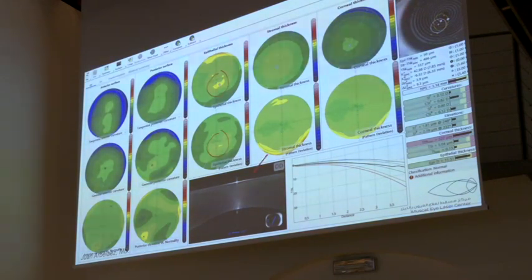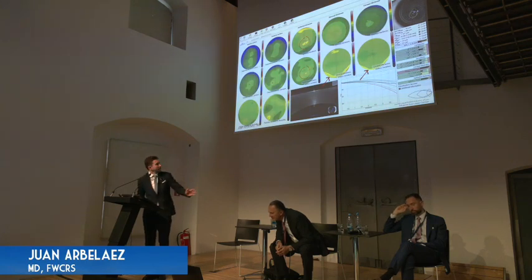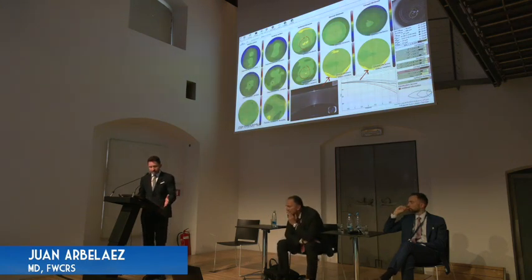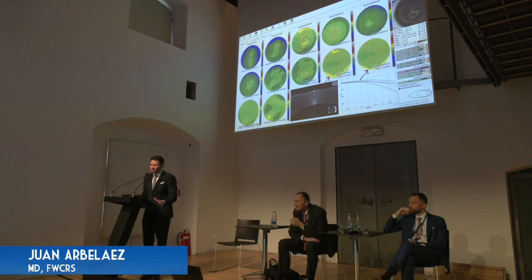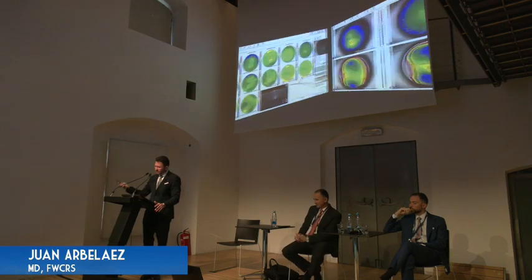So here he pointed out very well, we have a thinning in the area that we are expecting in the left eye, in the right eye, that the keratoconus might be happening. And the pattern deviation of the stromal thickness confirm that this is a case of keratoconus. Someone might say, no, not really convinced. Let's see the fellow eye.